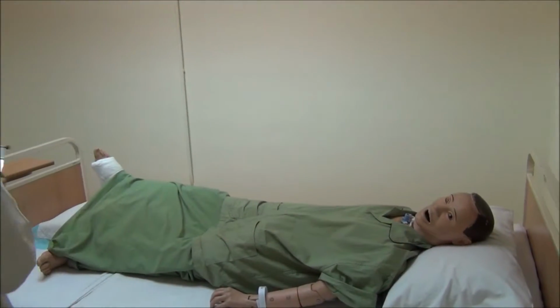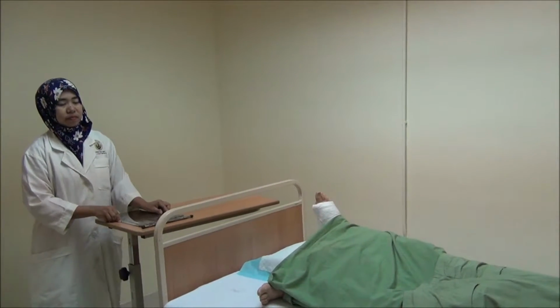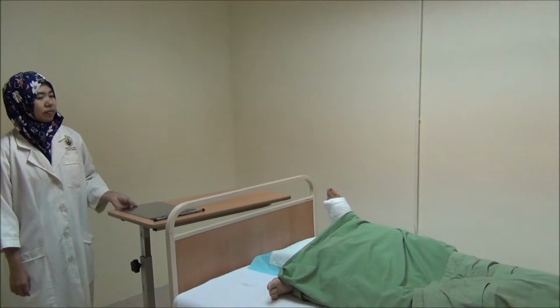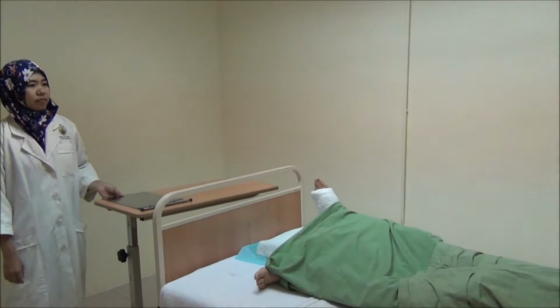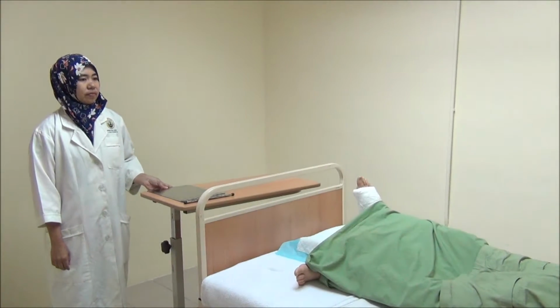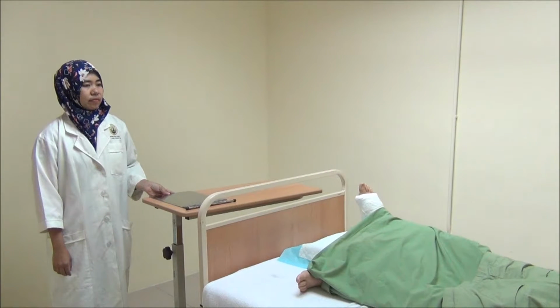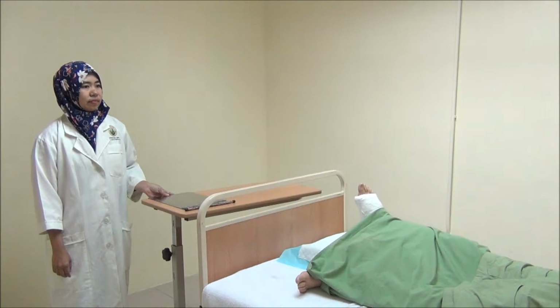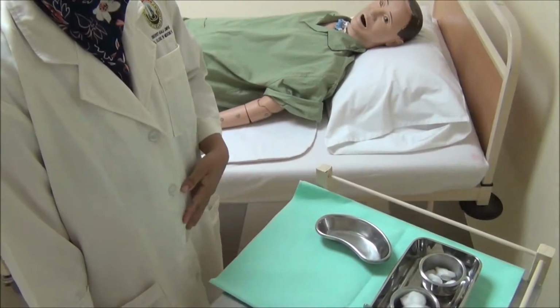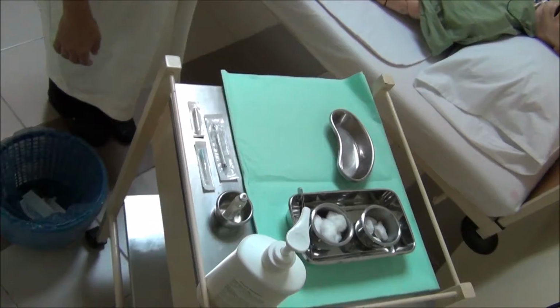So, she read and explained the procedure to the patient, the medication to be administered, and the purpose of it. This is to establish rapport, gain cooperation, and allay anxiety. She also checked doctor's order and patient's medication administration record to prevent medication error. Now, she will prepare the medication. So she has checked it's the right patient, and now she will check that it's the right medication.